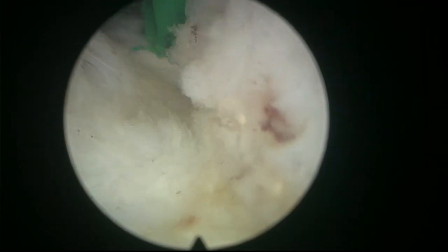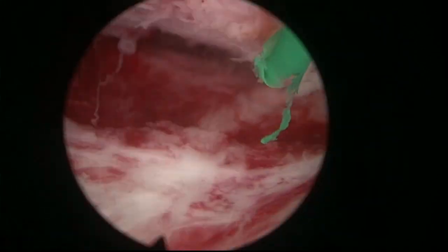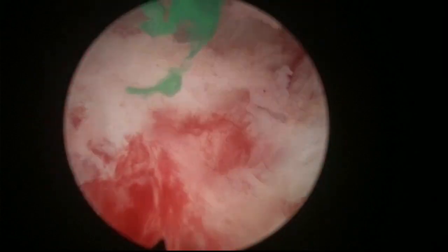There we go. Good. So this is almost done now. Just have to release the lower aspect. So for that, I'm going to try to connect, let's say, the lateral with the posterior. See if we can take.